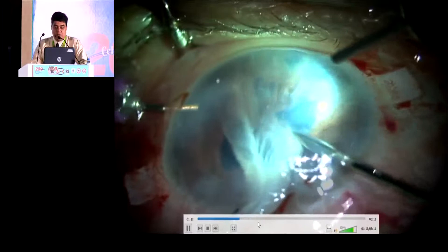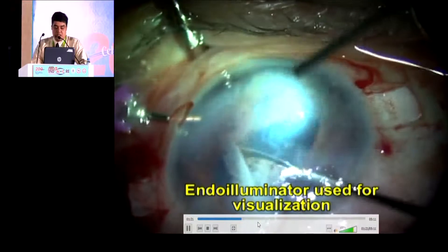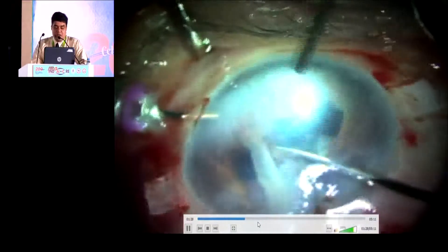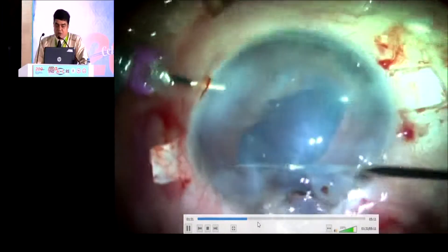Gently, as far as possible, we are trying to preserve the iris tissue also. All the adhesions are cut and visualized very well through the endo-illuminator. Once this is cut completely, we will try to remove the scar Descemet strip along with the endothelium.